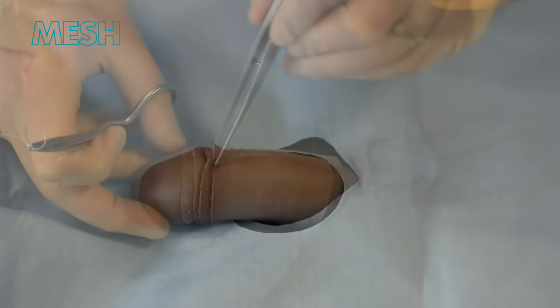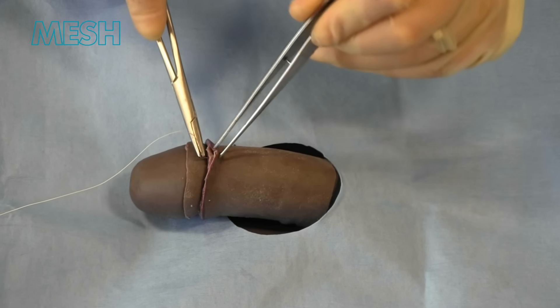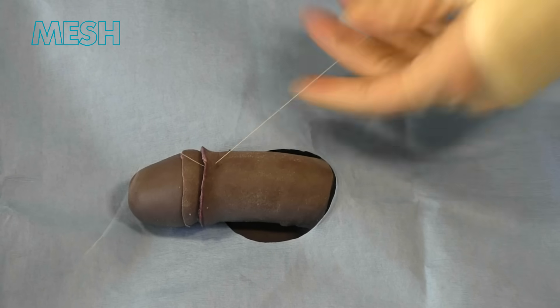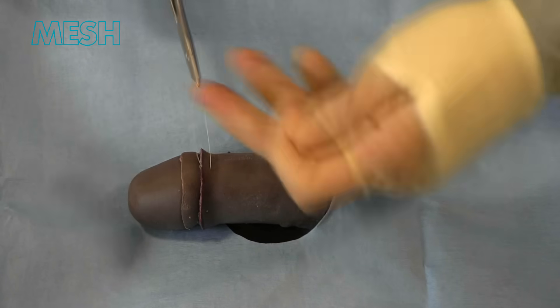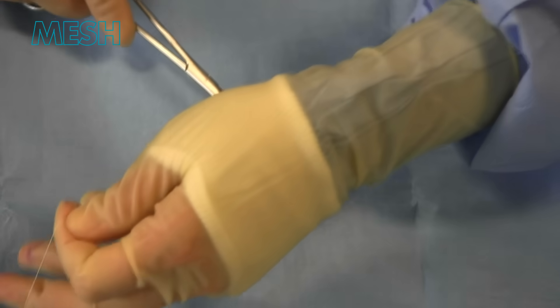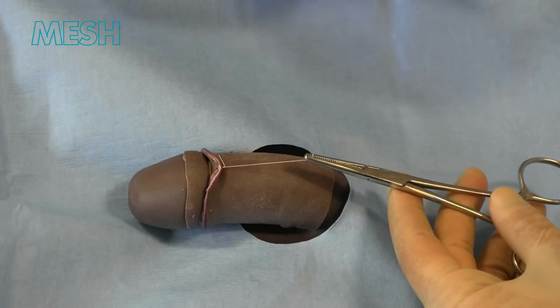We can see the two layers of the inner and outer incisions now, and these are the layers that need closing. The first suture is placed on the dorsal aspect. We are using 3-0 Vicryl Rapide in an interrupted fashion with instrument tying. This suture is left relatively long so that a clip can be placed by your assistant to help with further suturing.